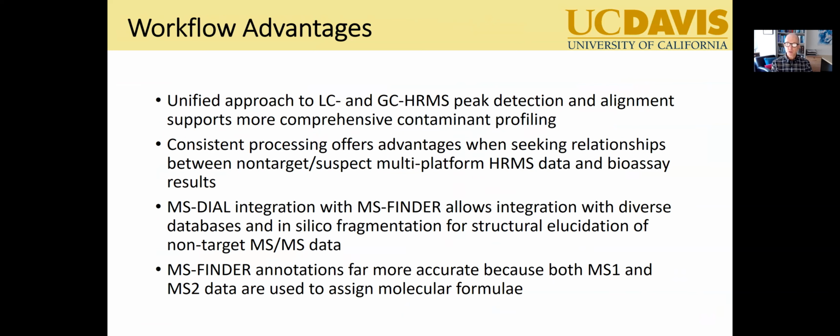So why do we use this workflow instead of the workflows that are available through Agilent or through other open source programs? And the short answer is that because we're using both LC and GC data and we want to merge those two data streams, having a single programming approach, which allows us to process both sets of data in a consistent way, is a huge advantage for us.